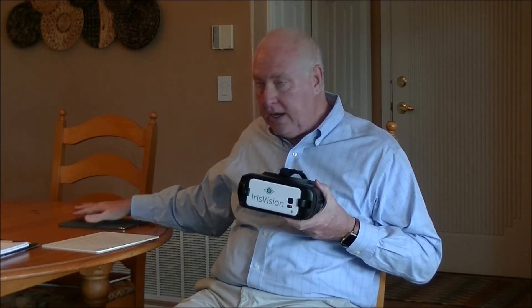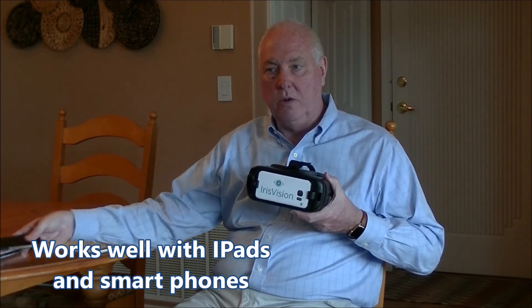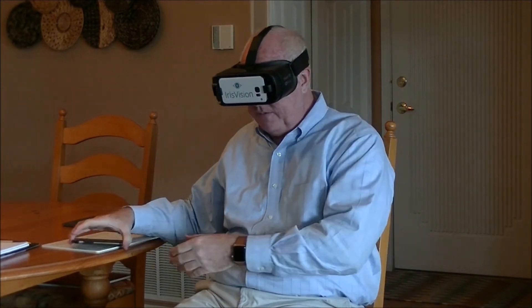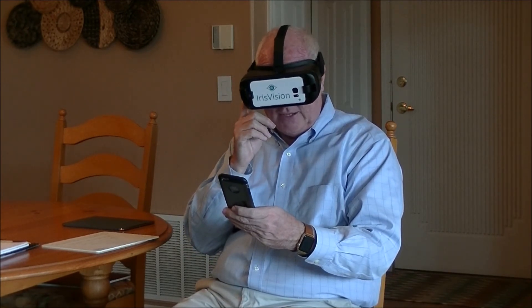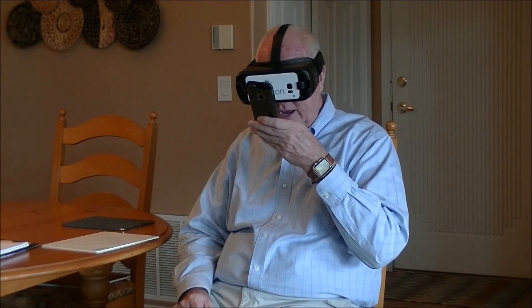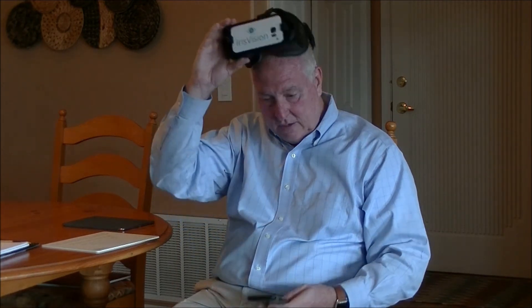When using an iPad or smartphone, the Iris Vision works very, very well. You can zoom in at a normal distance and be able to see the text. And if you get to something that's light blue and hard to see, just bring it right up close to the camera, and you'll be able to see the magnification without always having to swipe.